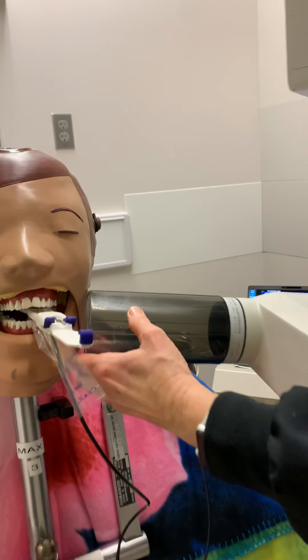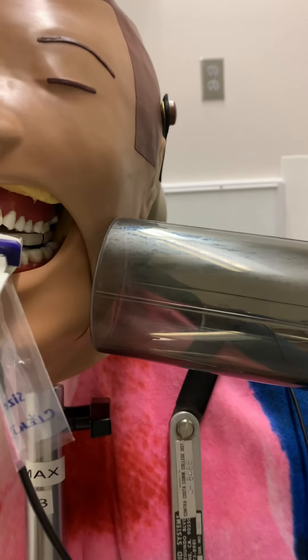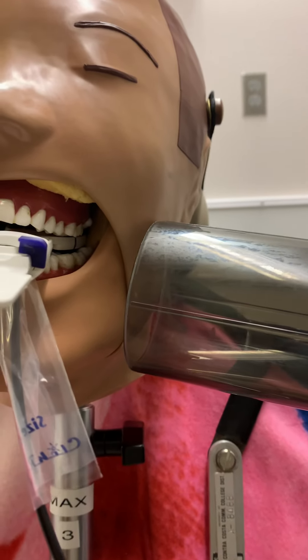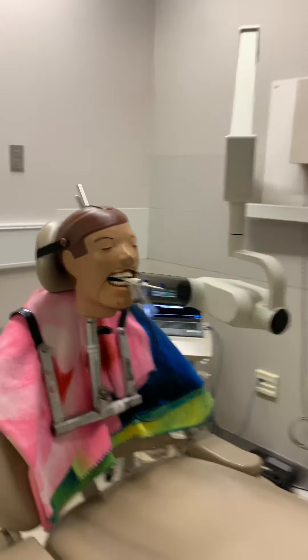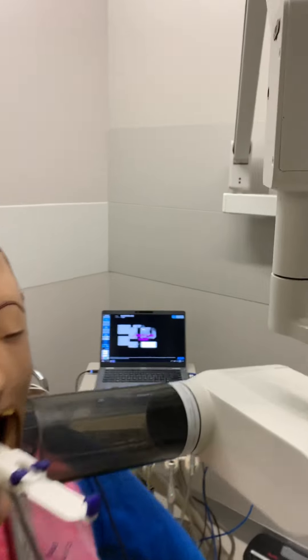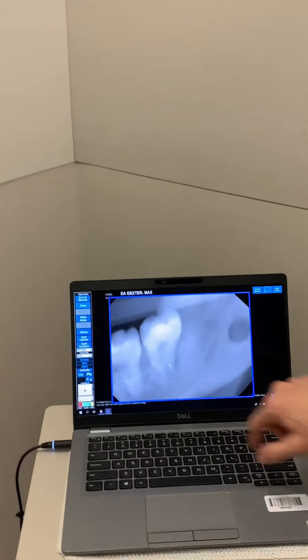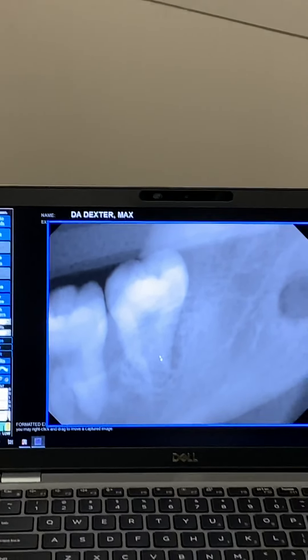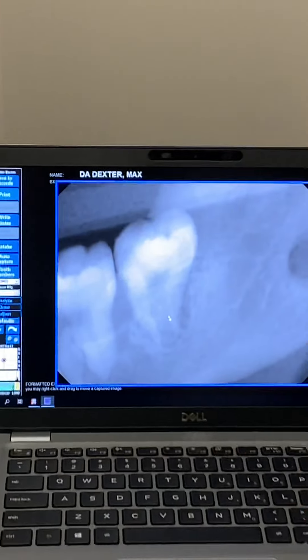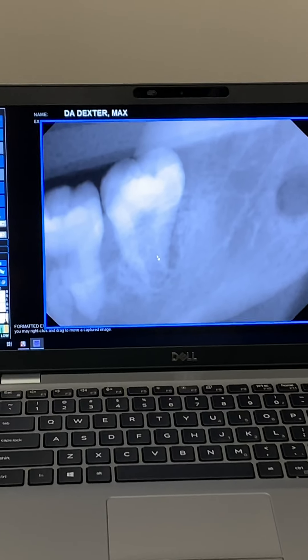I'm just going to rotate it back behind that tooth. Check it one more time, set my computer, and we're going to go expose that. And there's that little tooth right back here. On a live patient I may have gone back a little bit too far — I probably wouldn't be able to get it back that far. But here it is, ready for that oral surgeon to pop it out.